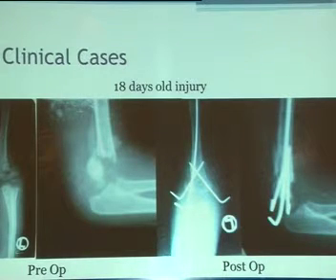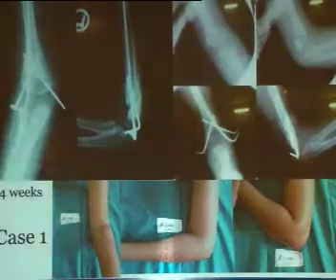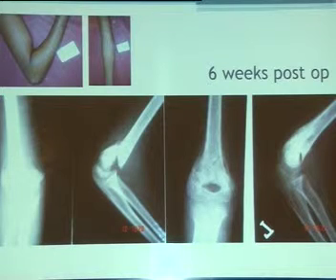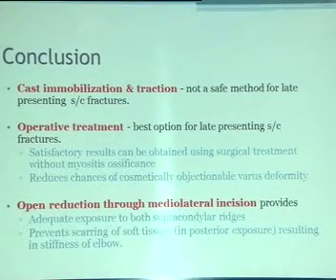So this is again an 18 days old injury with the callus, treated closed. This is 4 weeks. Again, another case, 15 days old injury, treated in the same way with almost good accurate Baumann's angle, and there's no deformity.